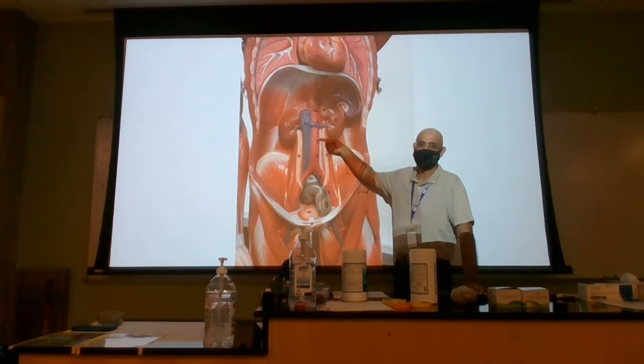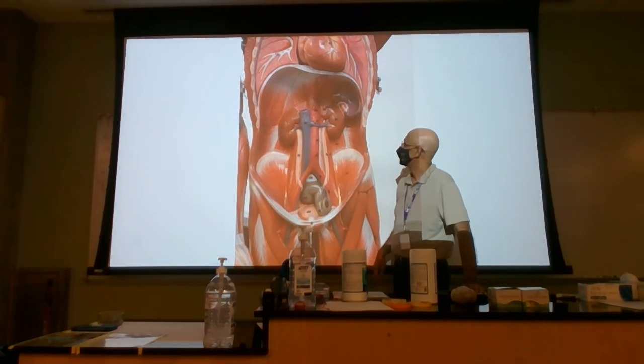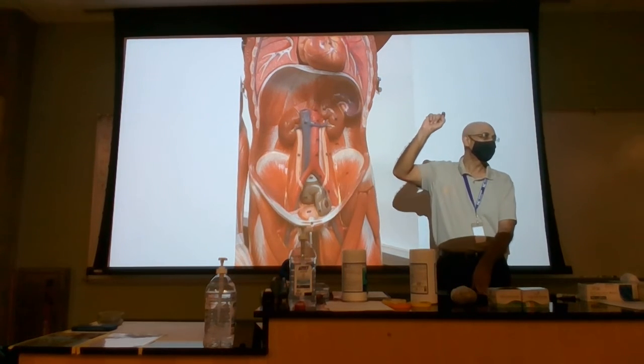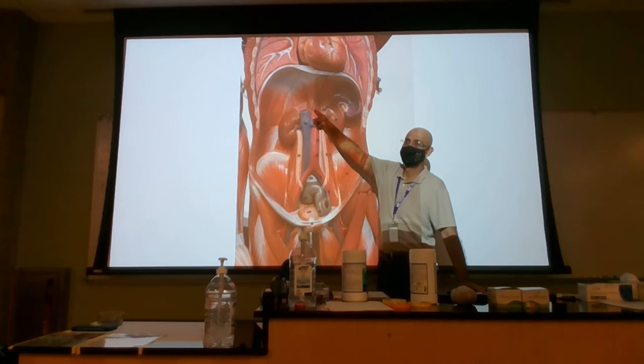Thank you. You guys are awesome. I thought you'd get this wrong. No, you are right. It's the descending abdominal aorta. Good job. And for the descending abdominal aorta, what I do is I look for this first branch just as it pierces the diaphragm. It's this first small half centimeter, 1 centimeter branch coming out right in the middle in the front. What is this called? Celiac trunk. That's a celiac trunk.